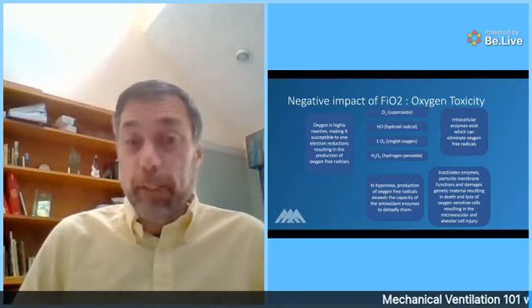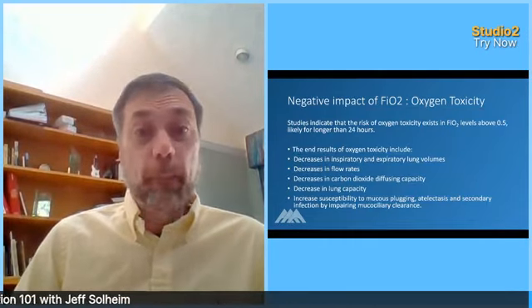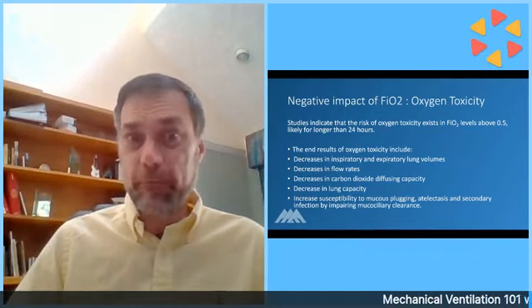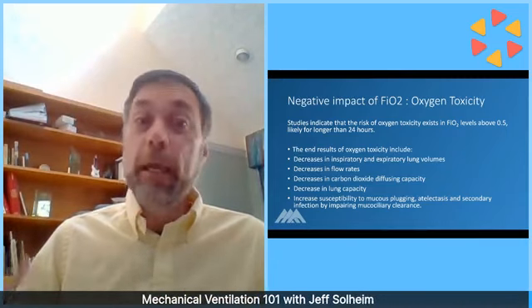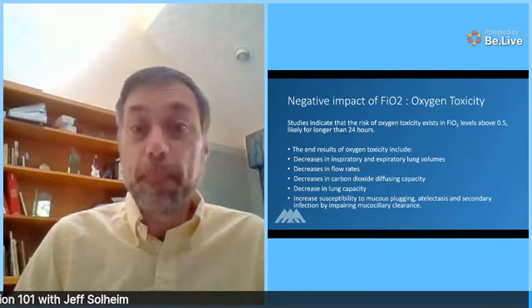There's another problem that goes with high FiO2s, and let me talk about that. We'll advance the slide. Before I get into the other problem, this slide just talks about some of the negative effects of oxygen toxicity. So if your patient remains on high FiO2s for too long, they can get into oxygen toxicity, and here's some of the symptoms of oxygen toxicity.